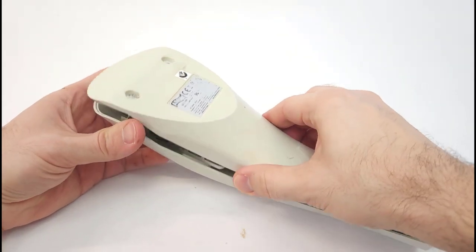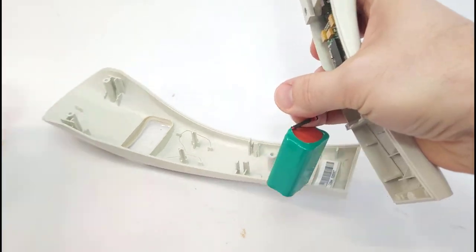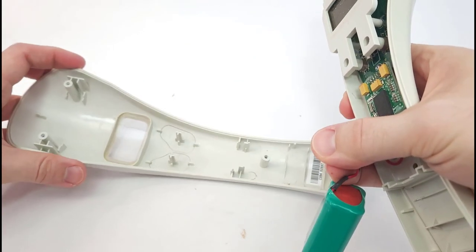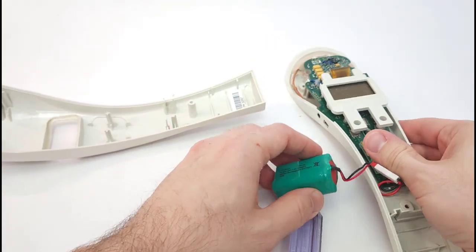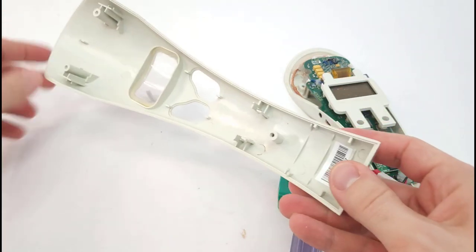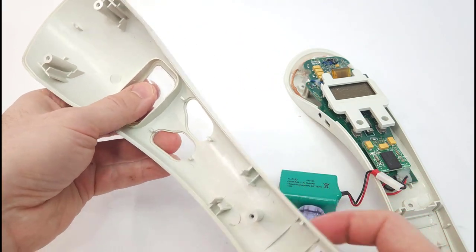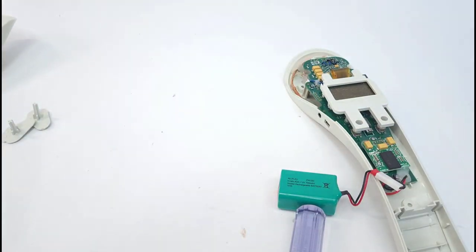Okay, once you've got those screws off, you can pop off the two halves of the case. Make sure you set your screws somewhere where you're not going to lose them. And we now have the top half and then the bottom half, which has the actual circuit board in it. Be careful if you flip this top half over because the two buttons on the front will just fall out, so you're going to have to get those back in later. I've also had this little plastic cover for the screen fall out and then have to pop that back in. So you can set all of that aside for now though.